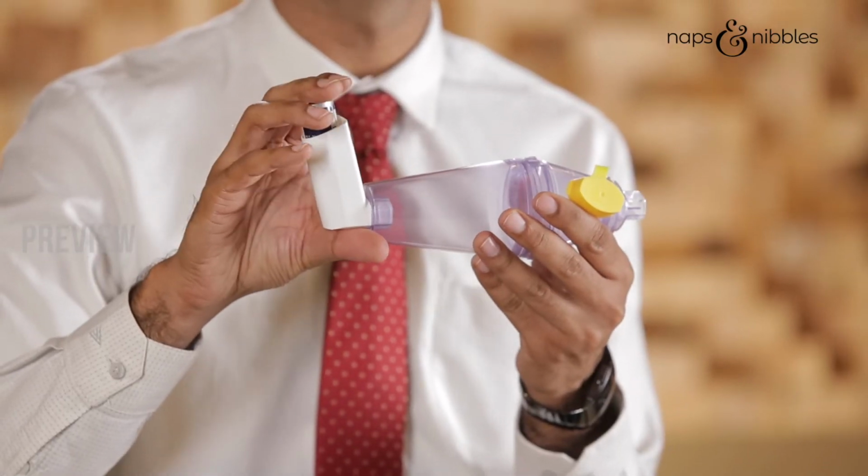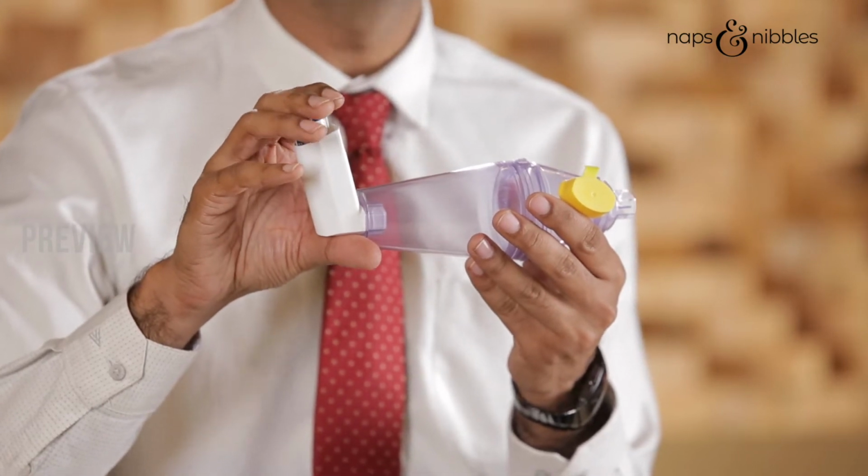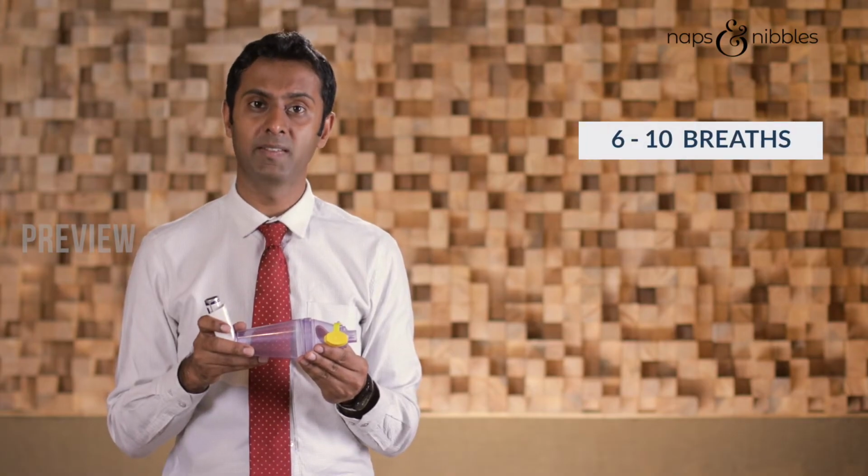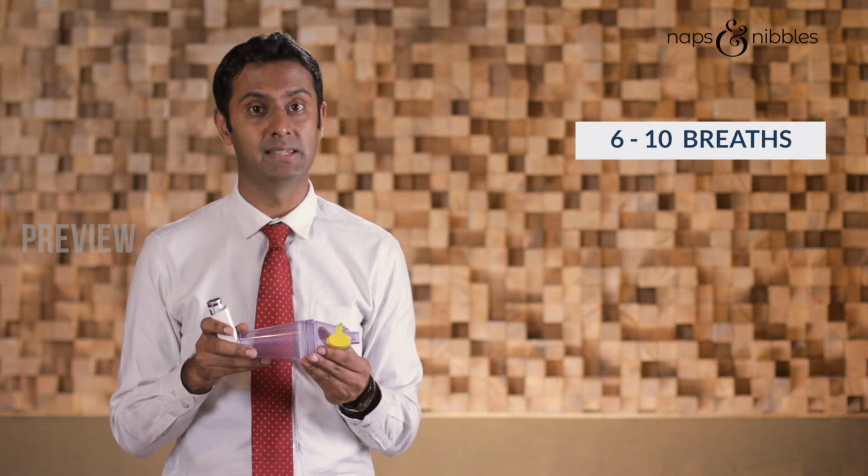To release a dose into the spacer, you have to press down the canister while holding the inhaler. You will see that there is a dose released into the spacer. Make sure that the child breathes in deeply through the mouth, thus inhaling the medicine through the spacer. Make your child take 6 to 10 breaths in a similar manner through the spacer.